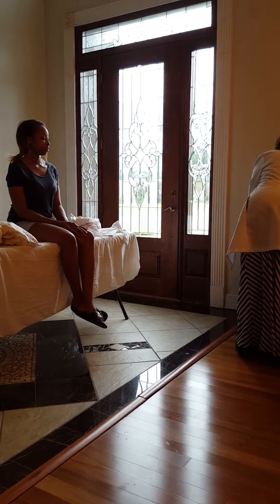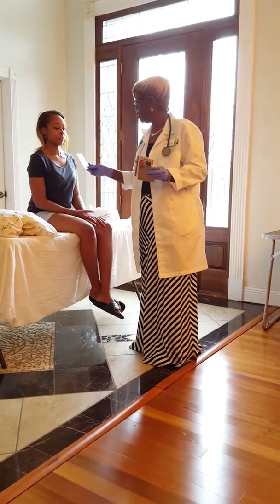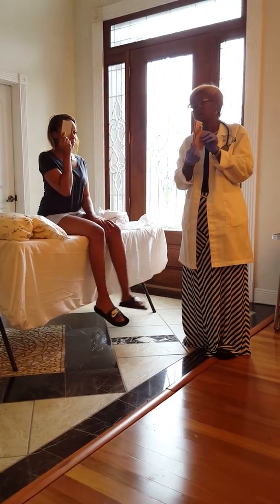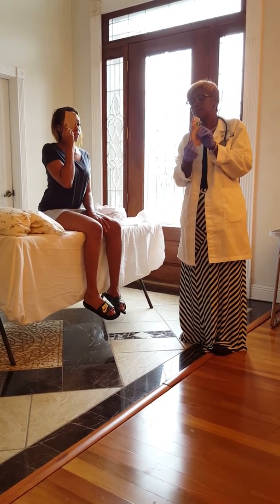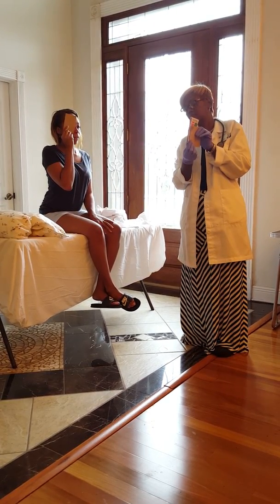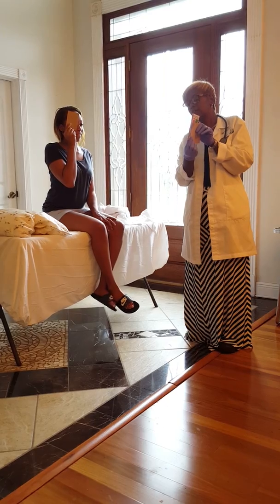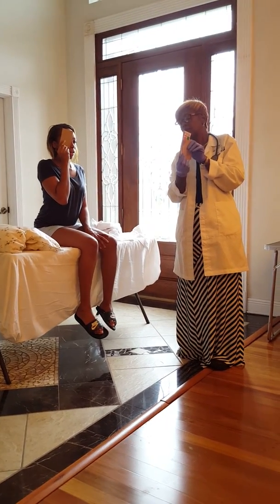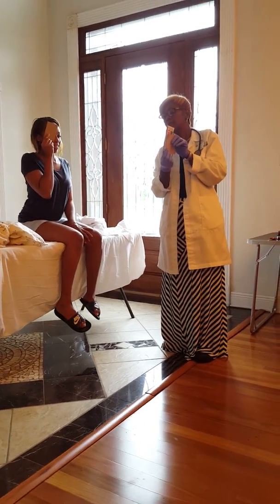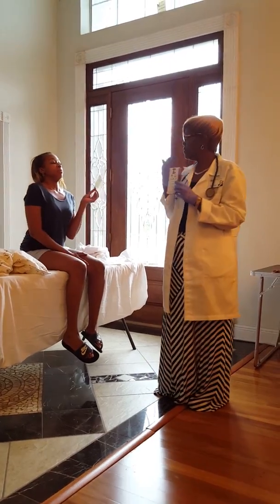Okay, so what I'm going to do, I forgot one thing. I forgot to have Ms. Smith read it with one eye covered. So can you cover one eye? Okay. Read the lines. E. TLNPD. CFTZ. LOPDE. NTFLCZ. PEZ. You can start over. FEZPDT. Okay. ECT. Okay. Now we're going to do the other eye. So that was her right eye, so we're going to do the left eye.